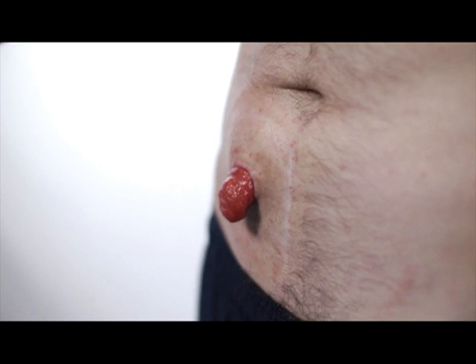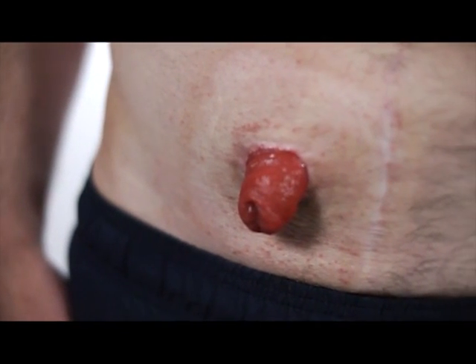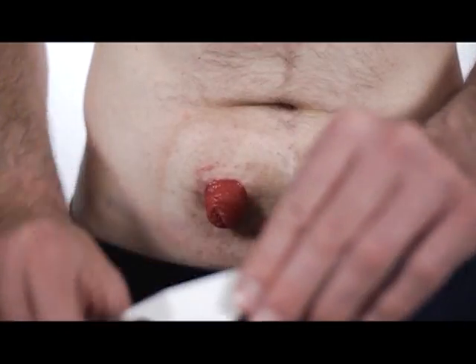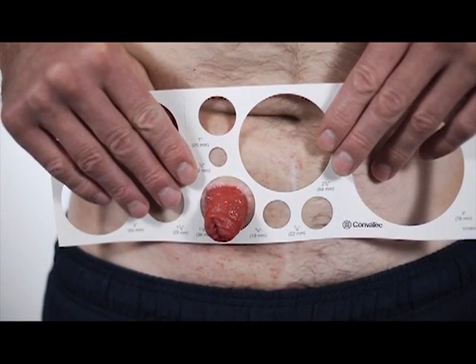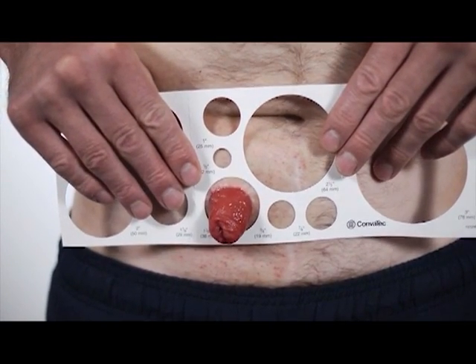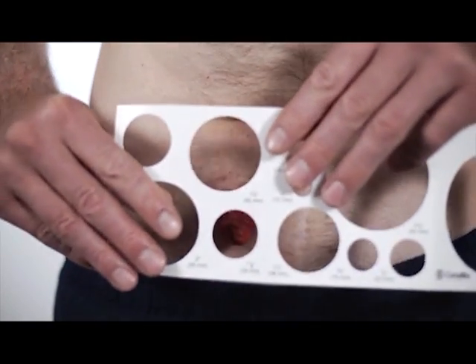Stomas come in many shapes and sizes, so it is important to choose the wafer and pouch that is right for you. Take the stoma measuring guide, place it over your stoma. Measure the widest part of the stoma, like this. Remember that your stoma will continue to shrink for approximately 6 weeks after surgery.